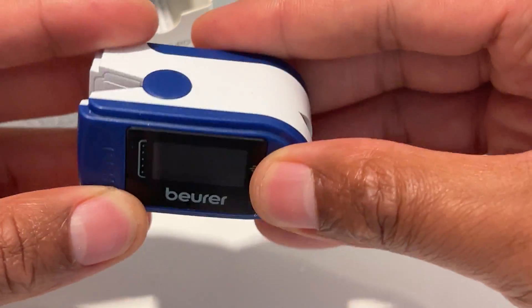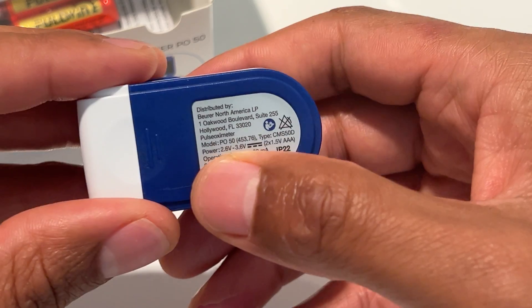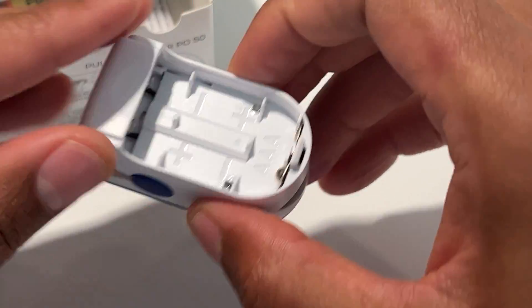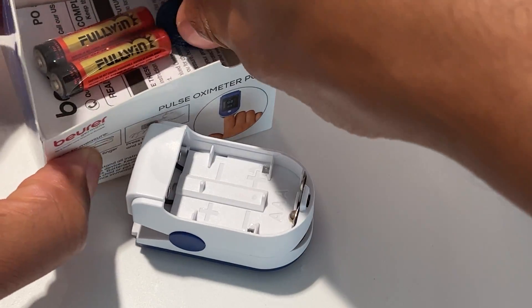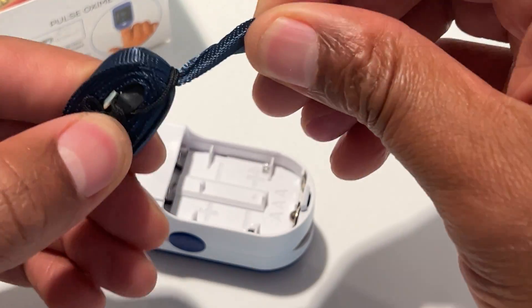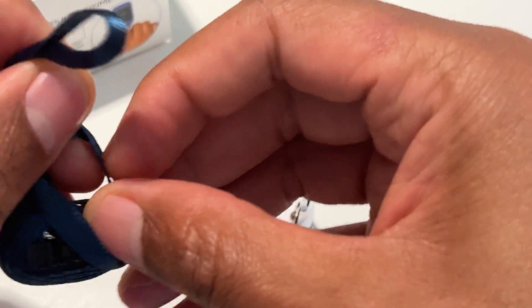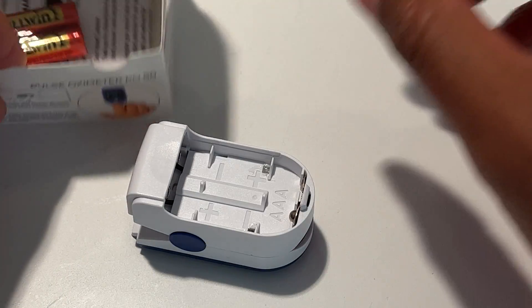It looks like this has been used a little bit — there's some scratching on top of it. I'm going to go ahead and pull this back and open it up to put in the batteries. Inside there's the strap that I talked about earlier. I'll pull that out and deal with it later.